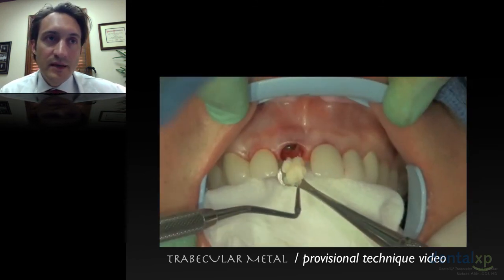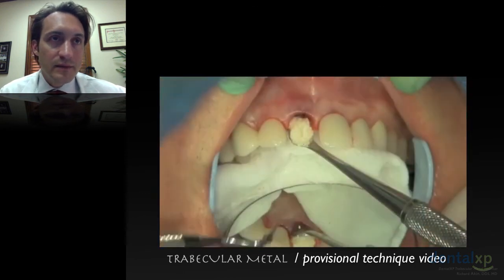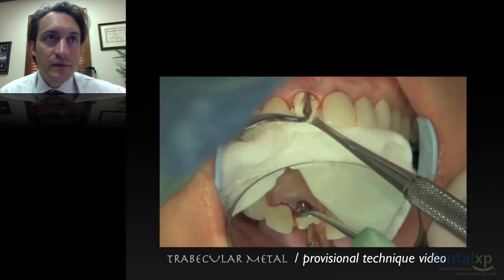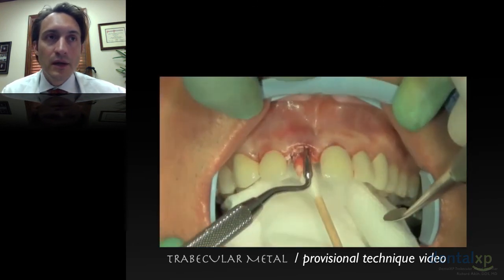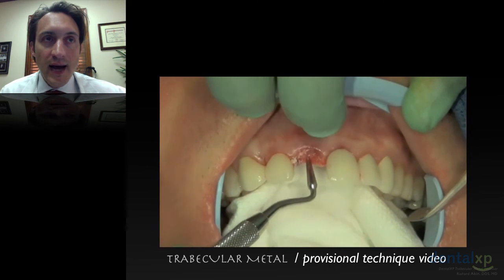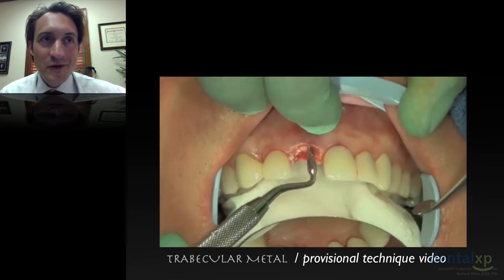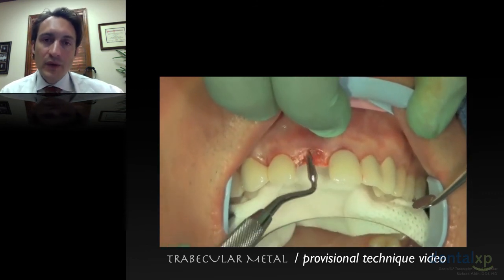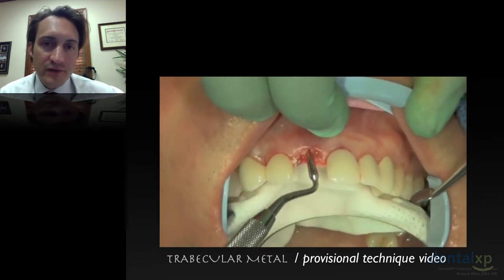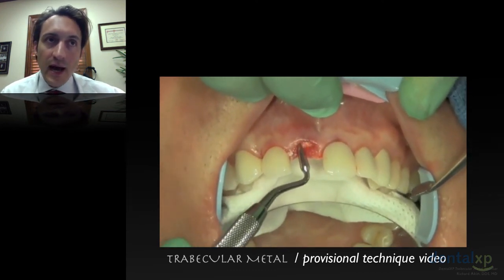In this case, like I had said, we're using a particulate xenograft. And we're compressing. This takes time. And of course, I've cut out a lot of the video here for you, but this is where I think you want to fill in all the voids. I like a firm compression of this material. This is fraction 3 with the xenograft, and I will compress.